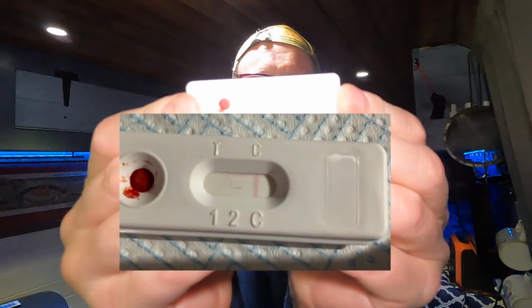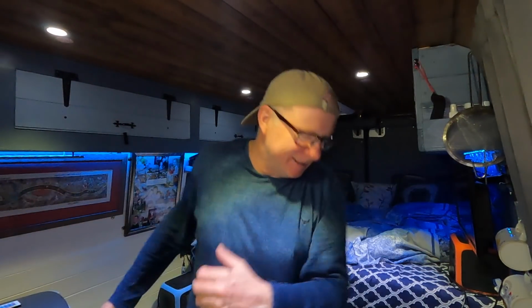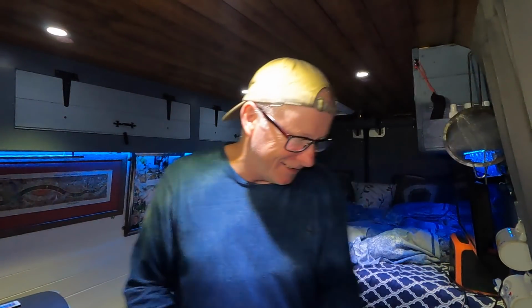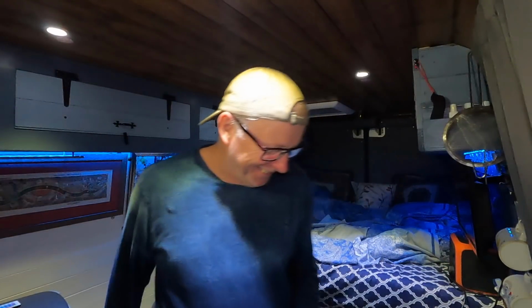Well, there you go, it's a negative test, only one little line there, so that means I'm good to go. I'm going to live till I'm 100 years old, hopefully. Now, like I was about to say, if you're thinking about doing one of these tests, I highly recommend getting someone to help you. You saw me struggling to get the blood out of my finger, the little pricker. Yeah, it doesn't really, well, it is literally a little prick. So get someone to help you if you're going to do this test.